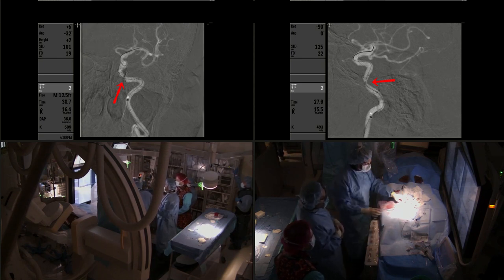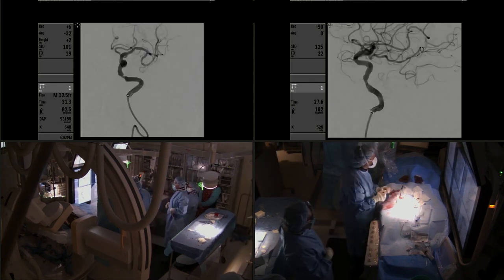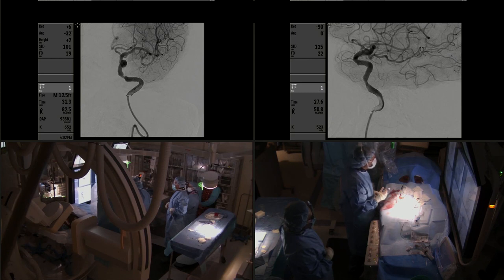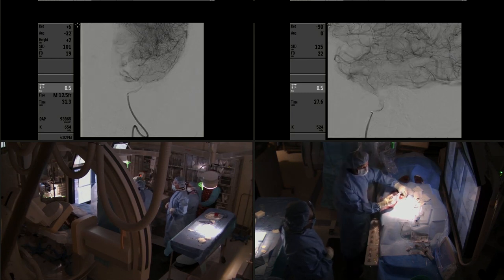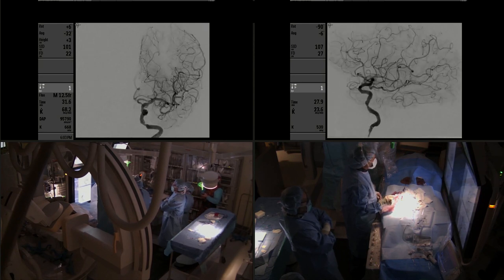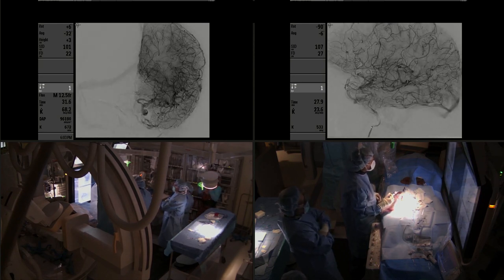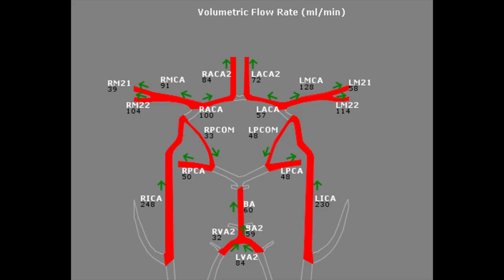Now we do a confirmatory angiogram to document revascularization without evidence of thromboembolic complications. This patient was premedicated with aspirin and Plavix in preparation for this procedure. After documenting revascularization, we follow up with this patient with blood flow NOVA measurements, which recovered after the treatment.